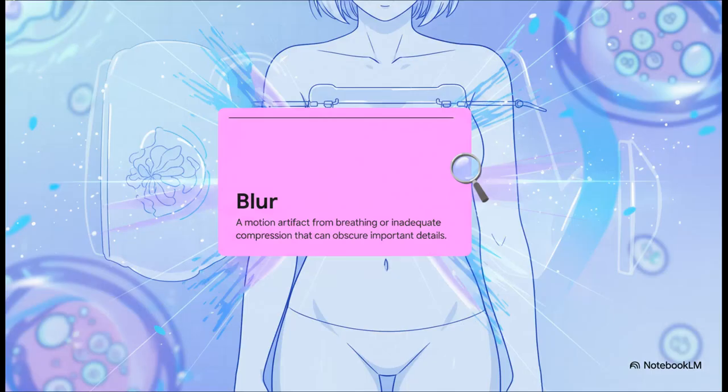And public enemy number one for sure is blur. It can happen if the patient moves, even just from breathing, or if the compression isn't quite firm enough to hold everything still. And the danger is pretty obvious, right? Blur can make those tiny critical details just disappear into a fuzz.